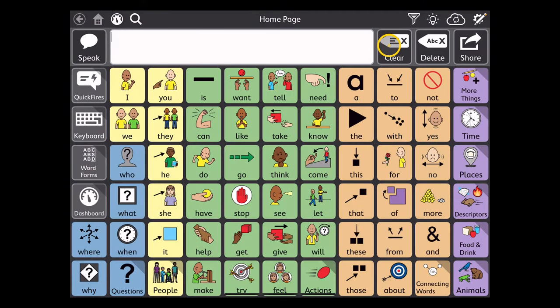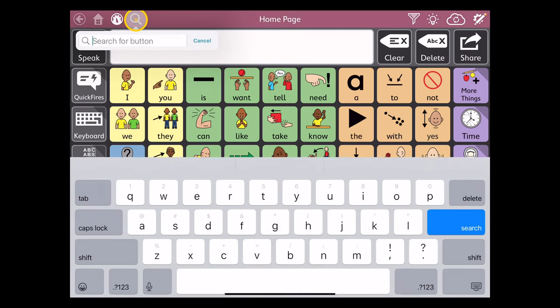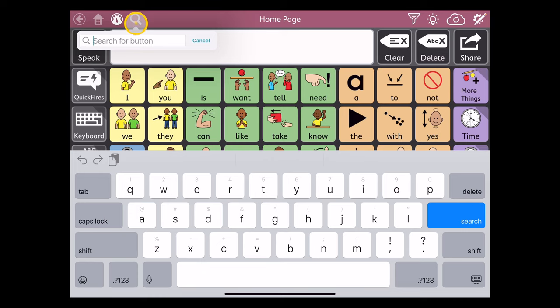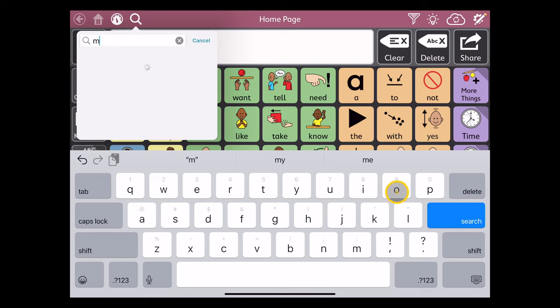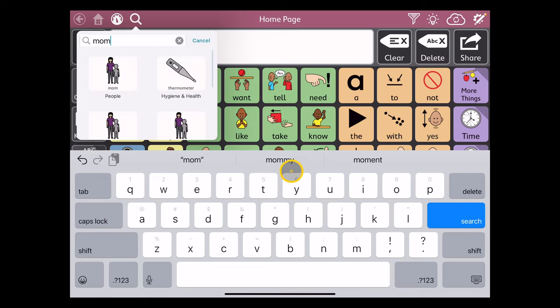In order to perform a search in TDSnap Motor Plan, it's essentially the same steps as TDSnap Core First vocabularies use. We tap on the search icon in the title bar, and we do a search for the particular terminology that we'd like to find.